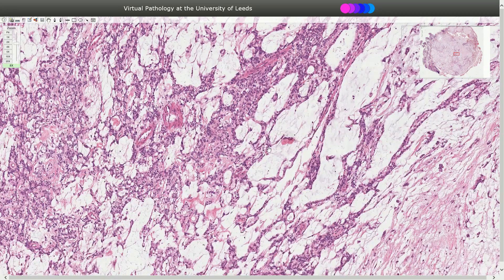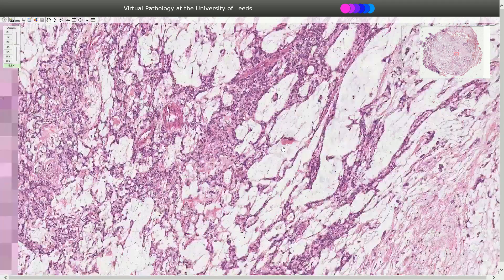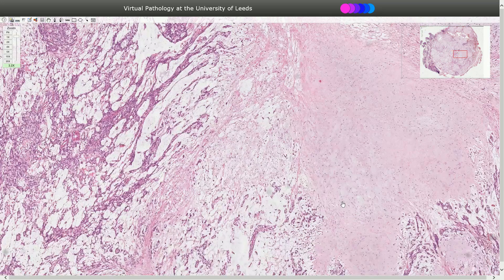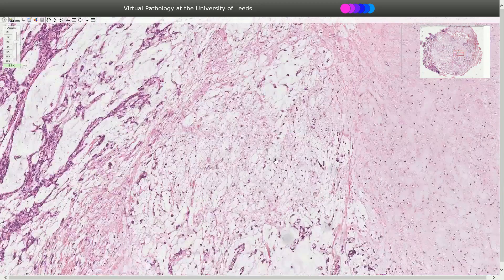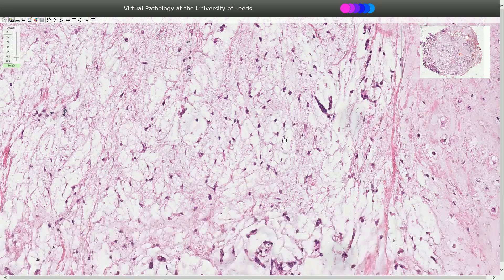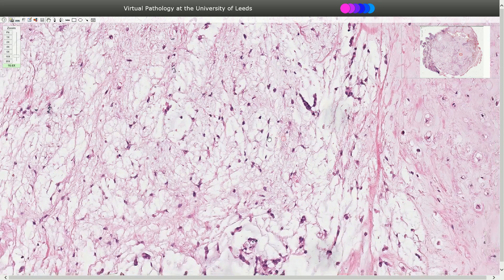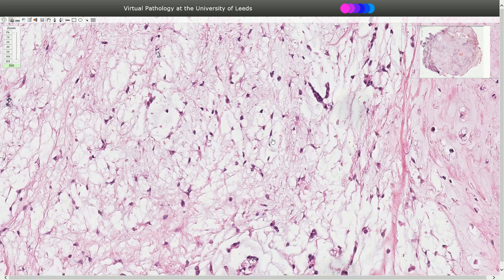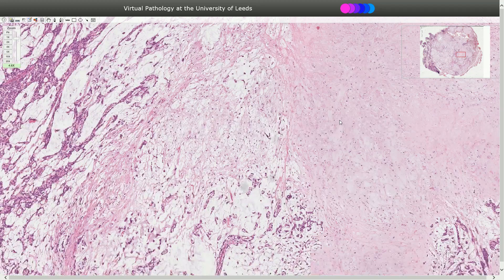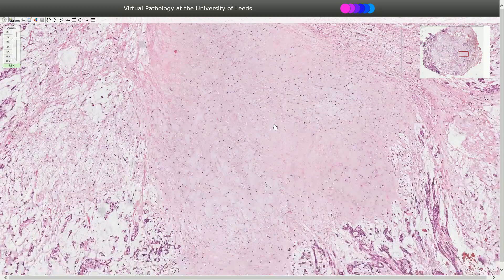In between the epithelial cells we can see the mesenchymal component, which is stroma. The stroma can have a myxoid appearance. Here we see the myxoid cells — the mesenchymal myxoid cells are usually spider-like with thin cytoplasmic strands. That's myxoid stroma.